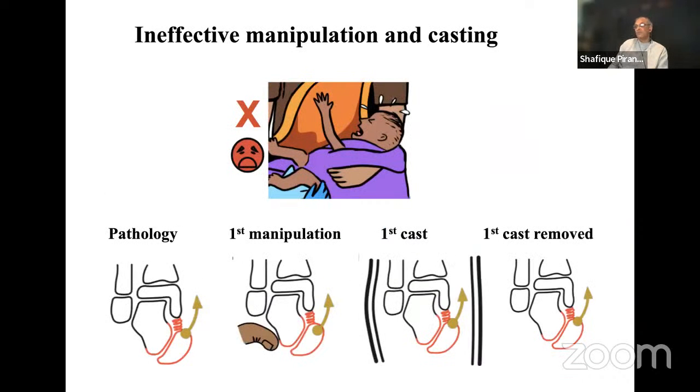What we want to do is to avoid that baby crying like that, because if they're crying like that and moving their legs, then the surgeon who's stronger than the baby will use all their strength. You want to use gentle pressure. But Darren, please tell us what you do, and there's always options to learn from different situations.